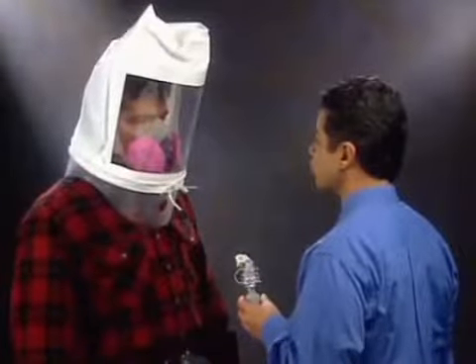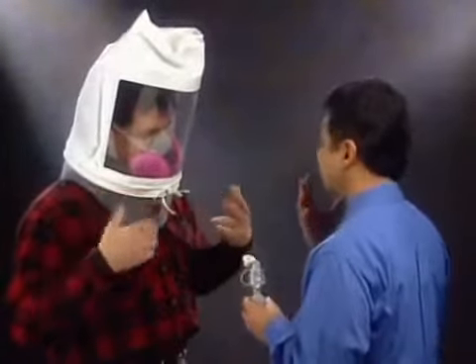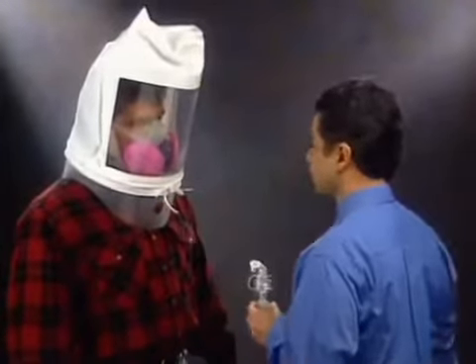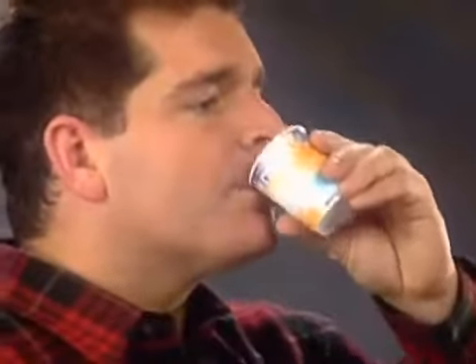If at any time during the fit test you detect the same taste you did during the sensitivity check, inform the instructor immediately. It means that your respirator does not fit properly. You must then refit your existing respirator, or select a different size or style of respirator. Once you clear the taste of the test agent from your mouth, you'll repeat the fit test procedure.